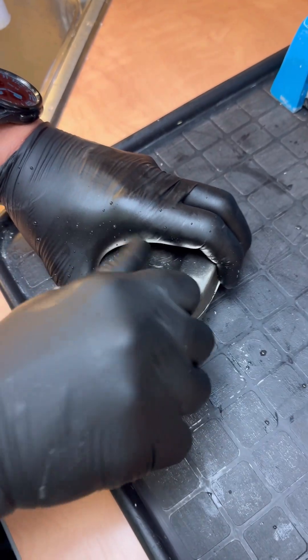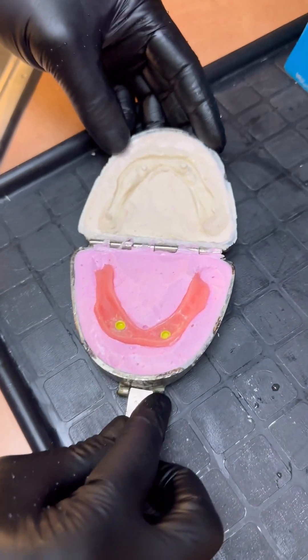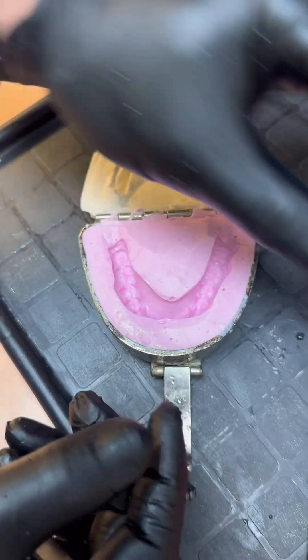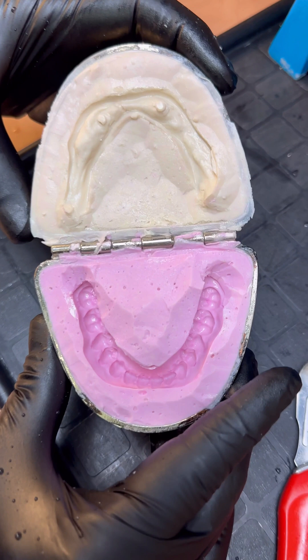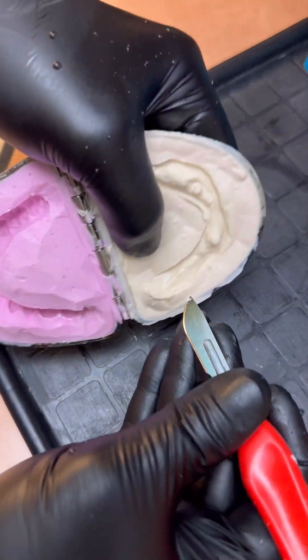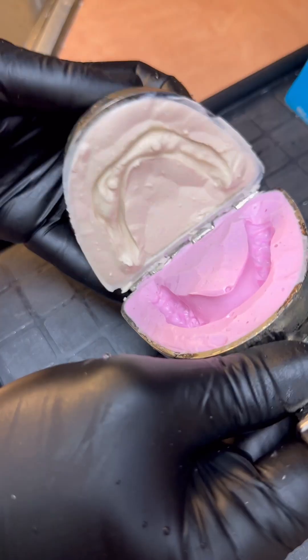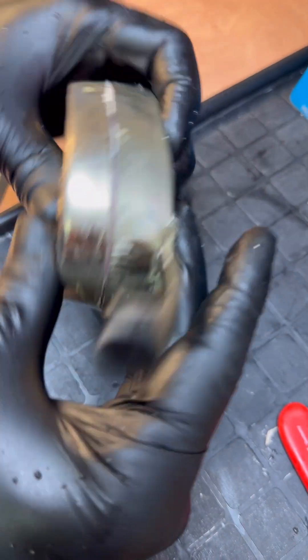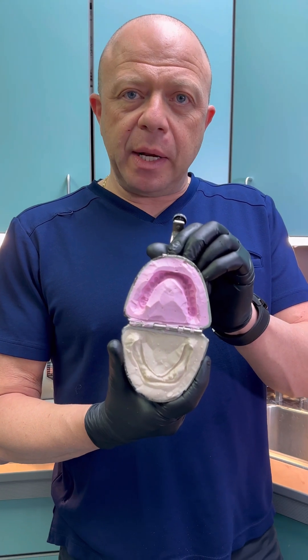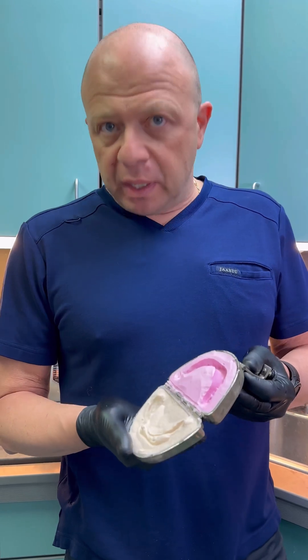The alginate is set. Let's open the flask and look at that — lift up the denture, set it aside. We have a beautiful duplication of the denture. If there are places with undercuts, trim it back a little bit. Here's our denture duplicating flask ready to go — a beautiful denture duplicated with both surfaces in a flask, nice and clean, and we're ready to make whatever it is that we want to make.